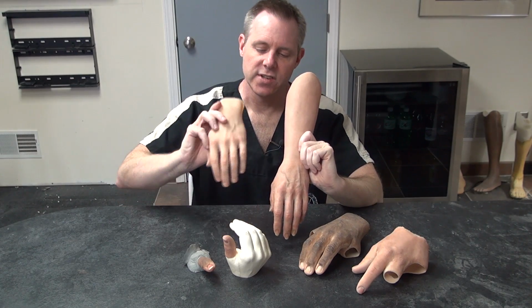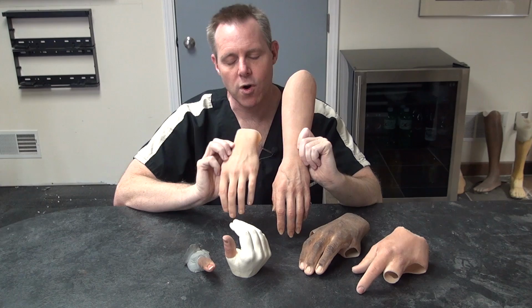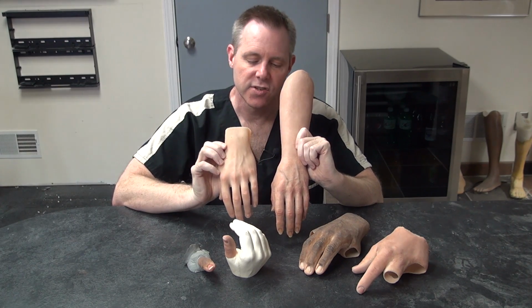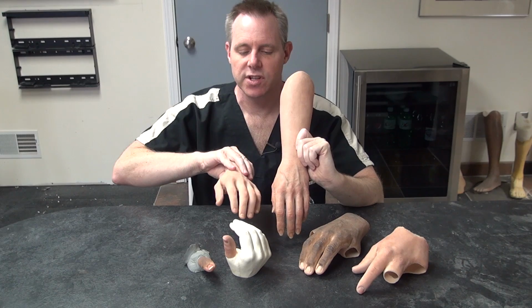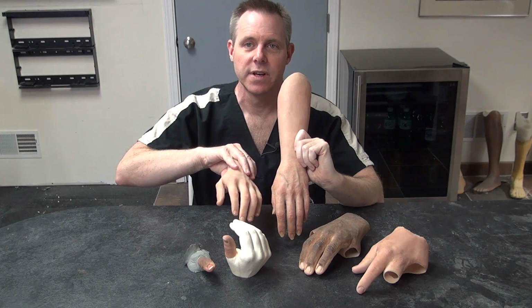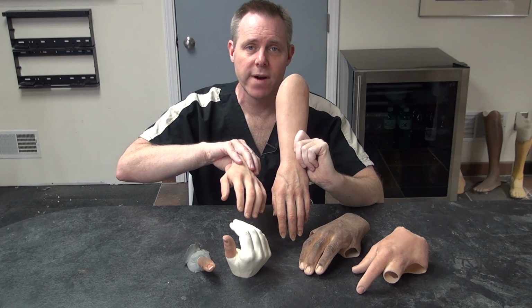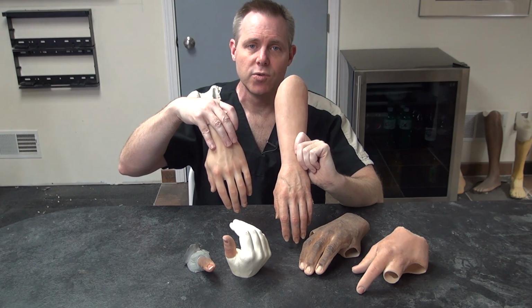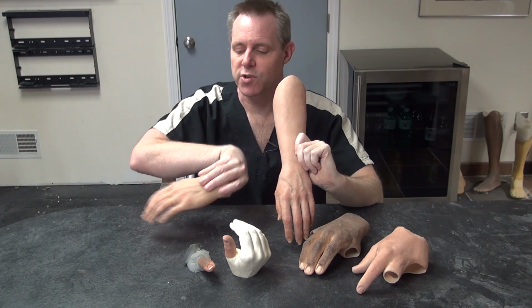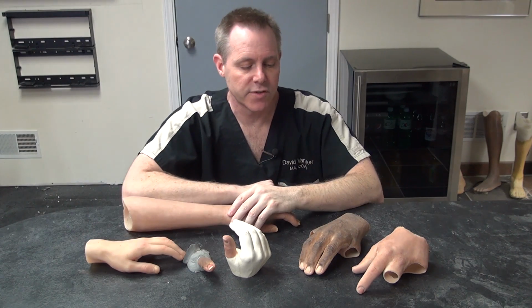Where this is nice is that this is in the early days, and we do a lot more of it now, and I'll talk more about it, which is internally colored, so that every detail on this is how the part came out of the mold. I've done no painting and no surface coloring whatsoever to this yet. So it shows you just how much detail you can create in your piece, and we're always pushing that technology farther and farther to create higher and higher levels of realism.